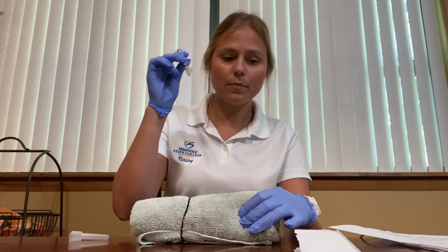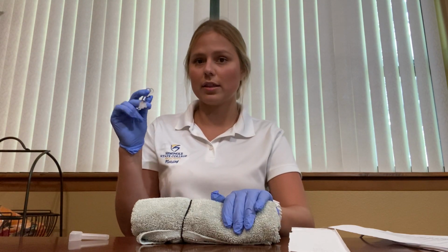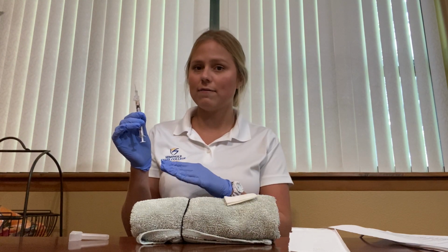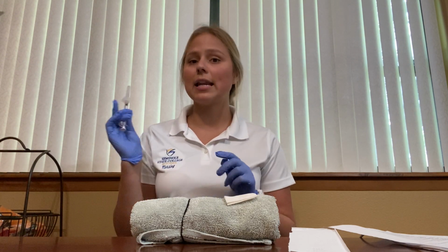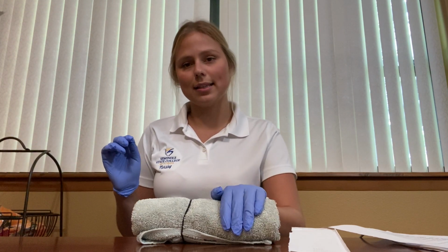Okay, remove my needle. And then I would apply some light pressure with the gauze. I'm not going to massage it or anything like that. And for the sake of the video, since I will be reusing this needle, I'm not going to engage the safety on the needle. I'm just going to do the one-hand scoop method to safely recap it. And again, if I had engaged the safety and everything, I would discard this needle in the sharps container. Then, okay, like I said, the light pressure.